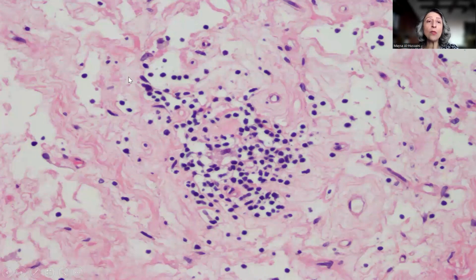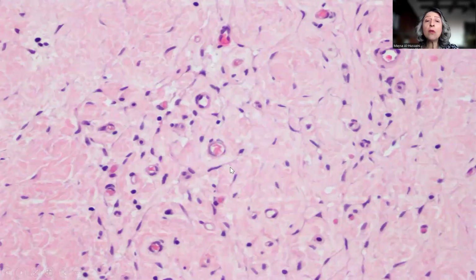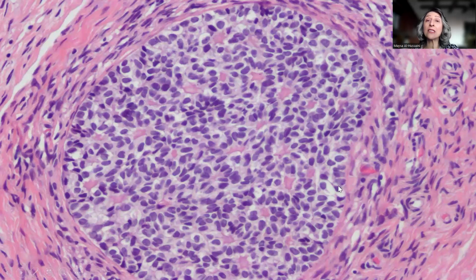This is one slide. This is the other slide showing some inflammatory cell infiltrate and fibrosis, but not much really in the way of the dysgerminoma cells that were present in the true cut diagnostic biopsy. What was really very interesting is that some of the sections contained what would be very similar to gonadoblastoma.